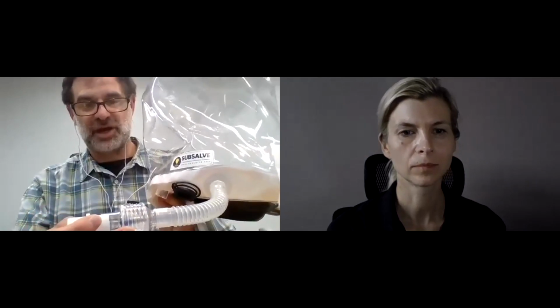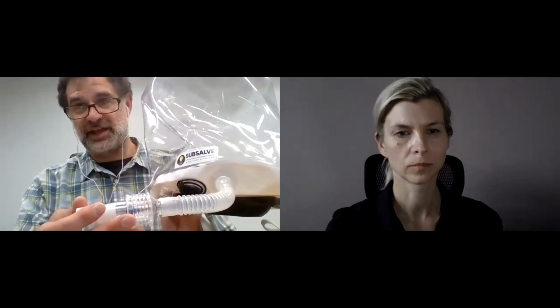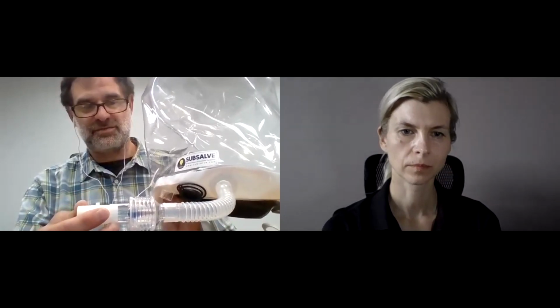So if you have a failure, even with the helmet ventilation, it's just simply going to fail open, which means the patient's no longer enclosed in the hood. They're in the hood, but it's open to ambient. Now, this of course needs to be tested to determine how much fresh gas can be drawn through that port. I'd suspect over time there's still some CO2 buildup in the hood itself, but this could be a pretty effective, easy way for any of the helmets out there to make the hood open instead of closed in an emergency. So at what flow does the valve open?